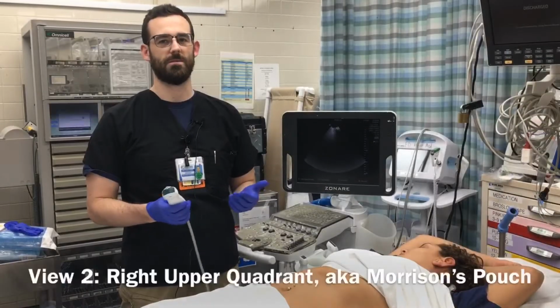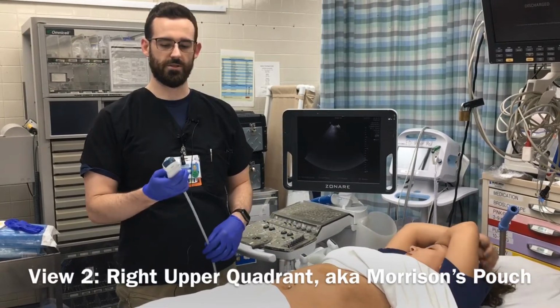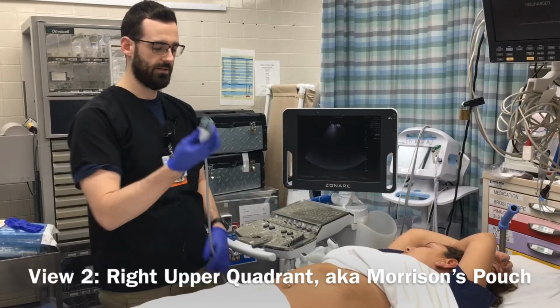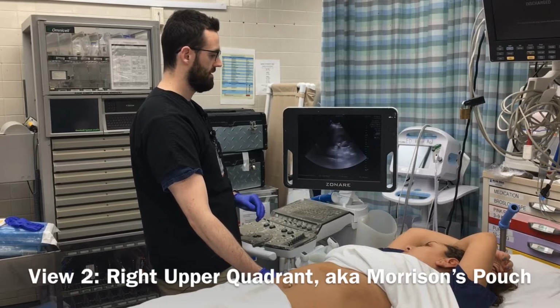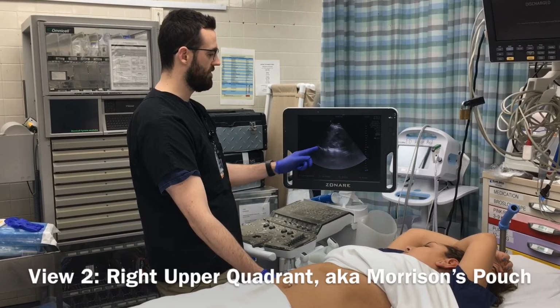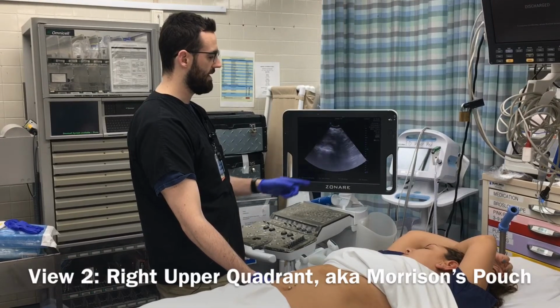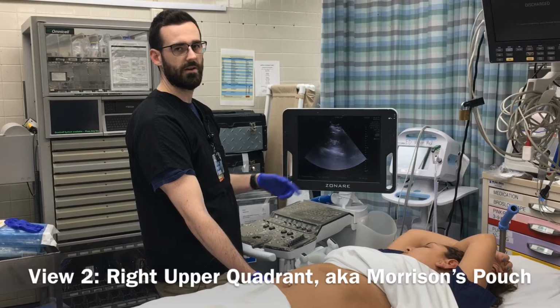Okay. So after the subxiphoid space, the next area you want to check is the right upper quadrant, or Morrison's pouch. Again, you want the probe marker towards the patient's head or your left, and you're going to go right where the liver and the kidney interface is. And what we want to do is make sure there's no free fluid between the liver and the kidney, and then we also want to make sure that we get the inferior pole of the kidney and also the liver tip, which is the most sensitive area in a FAST exam.